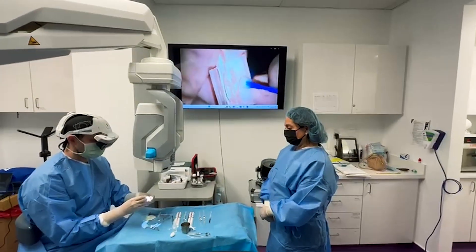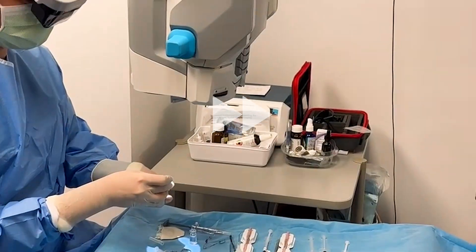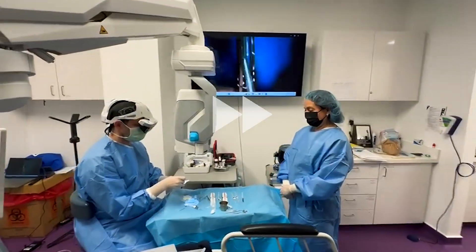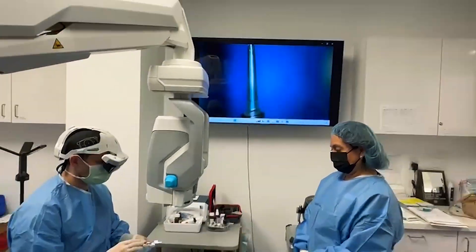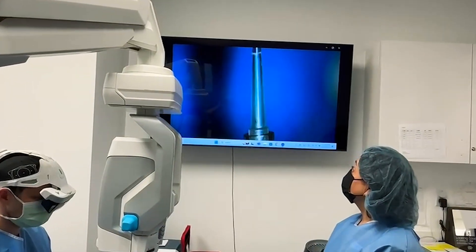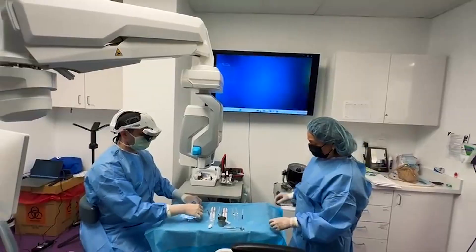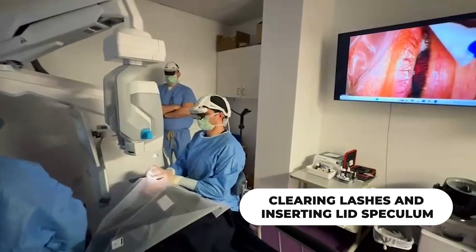I'm putting it in this inserter cartridge so that I can safely put it into the eye in the proper orientation. I'm using some special sponges that are designed just for this loading task. A surgical scrub tech can do this, but I like doing it myself just to make sure it's exactly the way I like it. I'm putting it into the inserter and also filling it with a little bit of jelly called viscoelastic solution that helps protect the eye and protect the lens during the procedure.